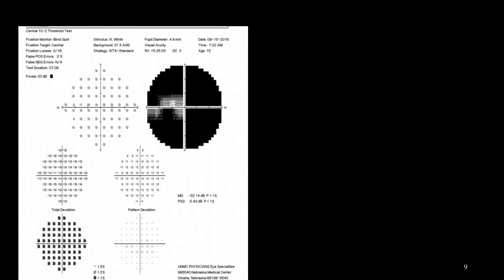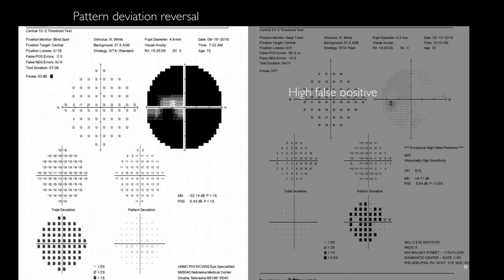This is an example of a patient with advanced glaucoma with dark total deviation, white pattern deviation, and is called pattern deviation reversal.